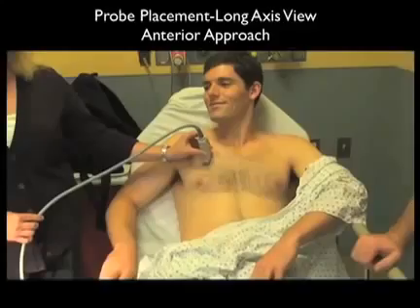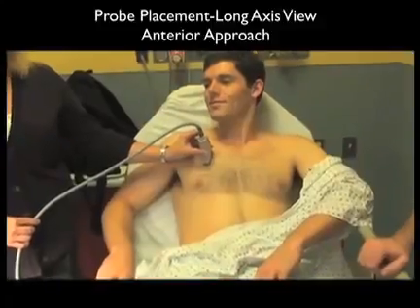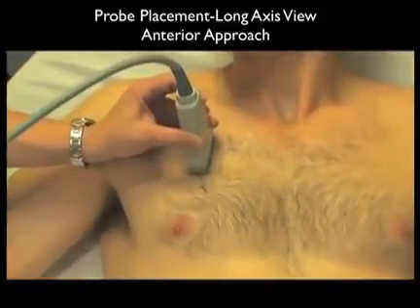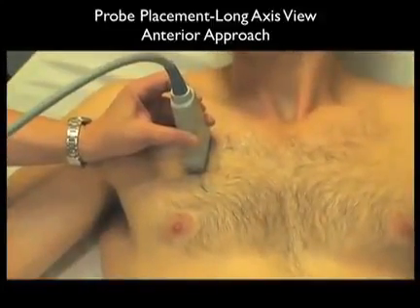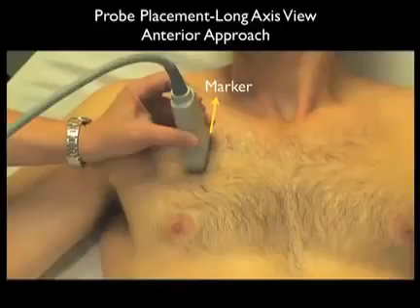Now let's learn how to perform the ultrasound examination for pneumothorax detection. Here we have the high-frequency linear array probe positioned on the anterior chest wall at about the mid-clavicular line, looking into about intercostal space 3. In most cases of pneumothorax with the patient supine, the air would be predominantly seen in this area.